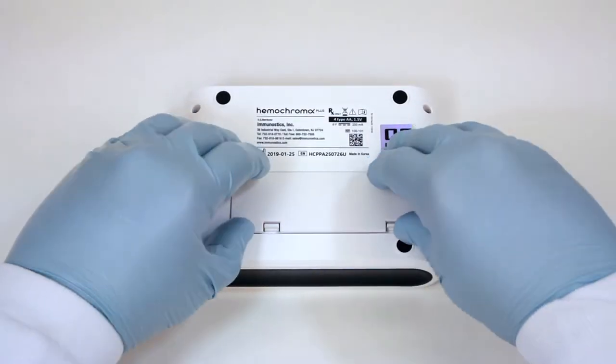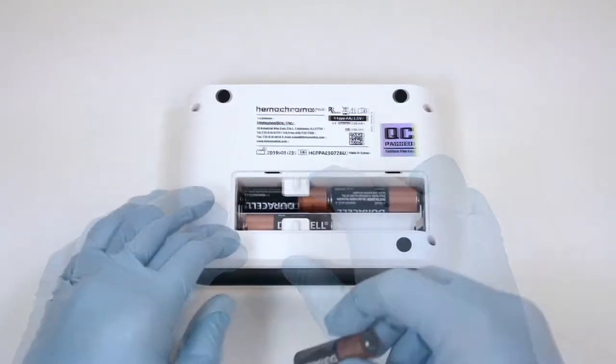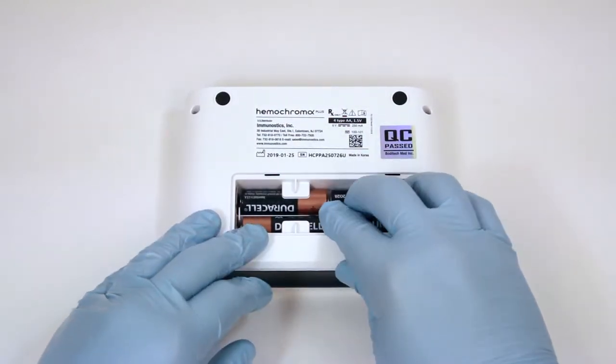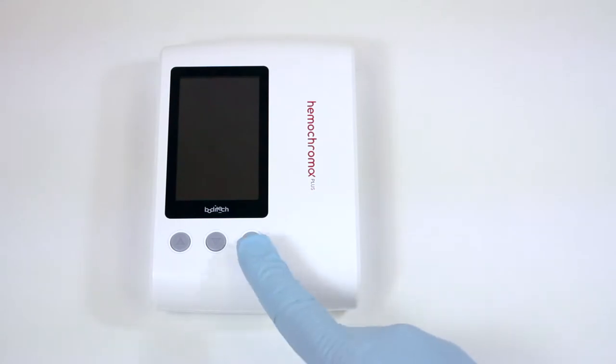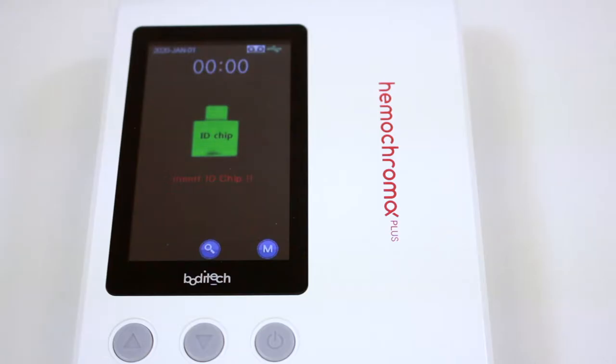Setting up Hemochroma Plus. Remove the battery cover provided at the bottom and insert the four type AA batteries. Press the Power On-Off button. The Hemochroma Plus Analyzer is ready for operation when the Display Insert ID chip appears on the screen.